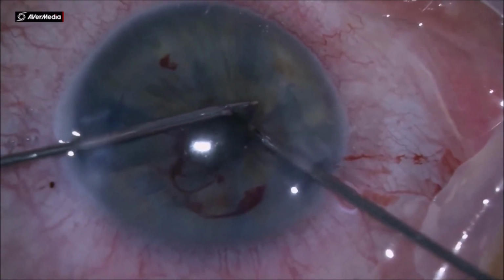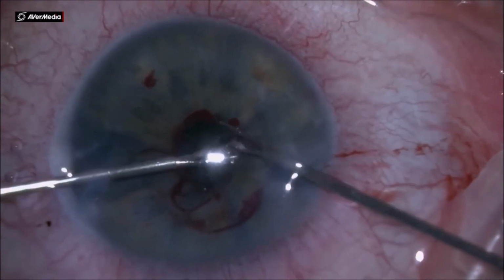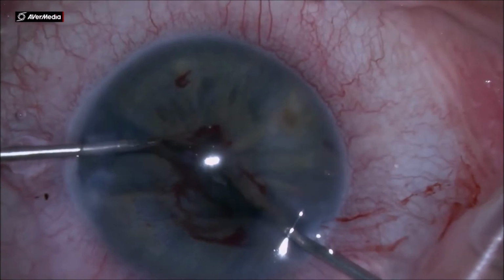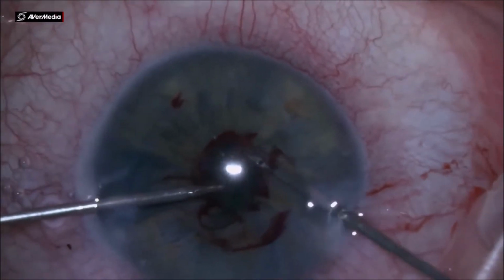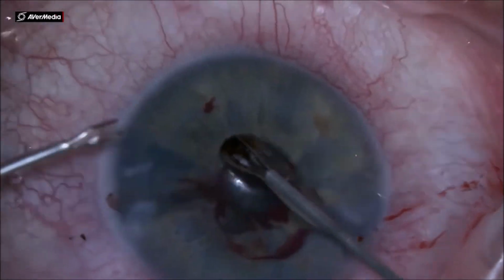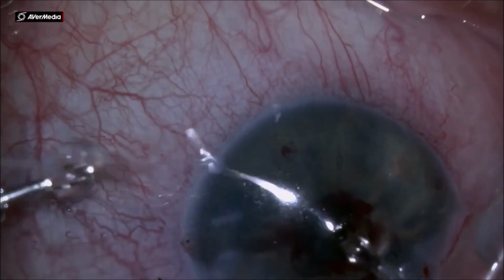next period post-op. Not only the anterior synechiae, in this case I also had the pupillary membrane, and then the phacoemulsification goes like a routine one, placing the Canabrava pupil extension ring and replacing the cataract with an IOL.